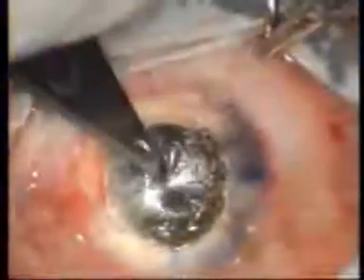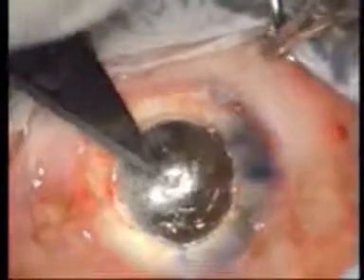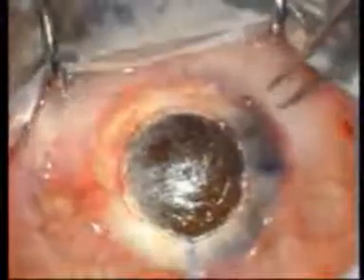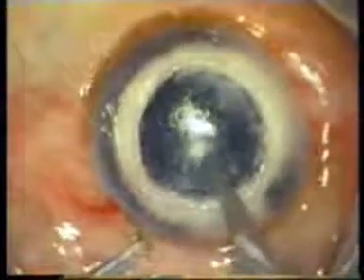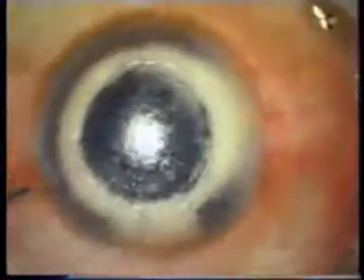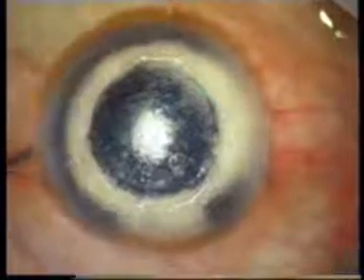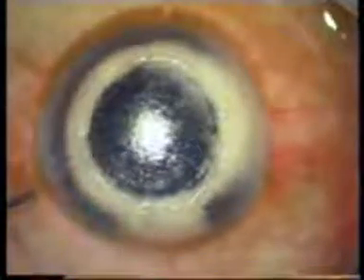In the classic big bubble technique, the bubble is punctured with a sharp blade in the centre of the cornea. Any sudden darkening of the dish-shaped opacity would indicate that the big air bubble has collapsed. At this point, the eye may be softened further by draining more fluid from the paracentesis.